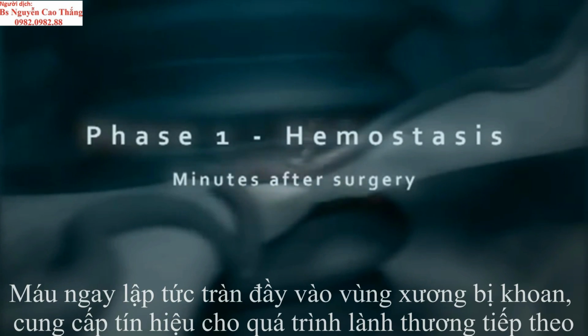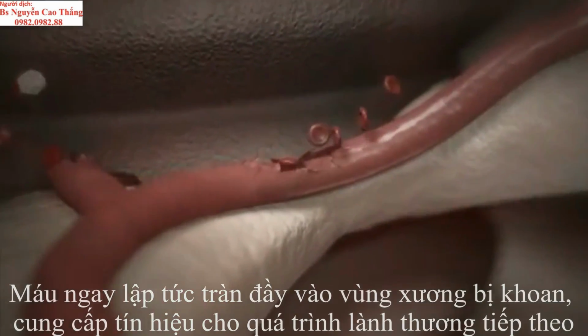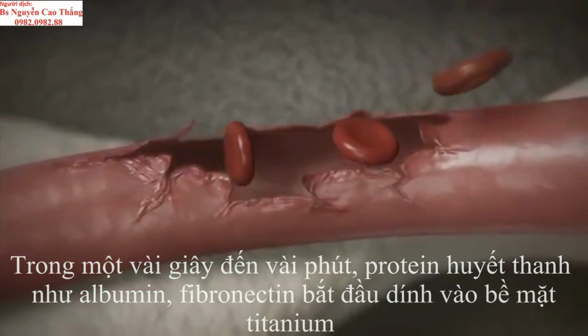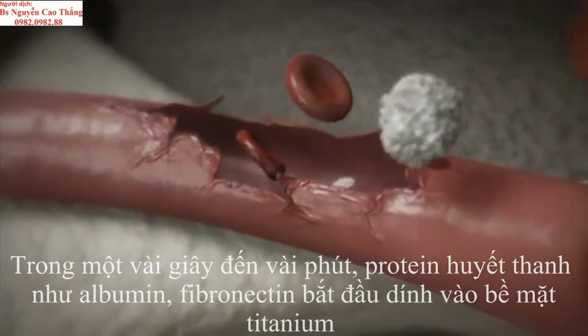The blood immediately perfuses the surgical site, providing the cues for subsequent healing. Within seconds or minutes, ions and serum proteins such as albumin, fibrinogen, and fibronectin begin adhering to the titanium surface.